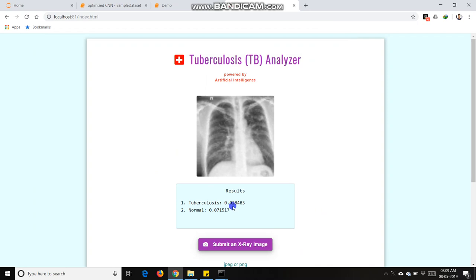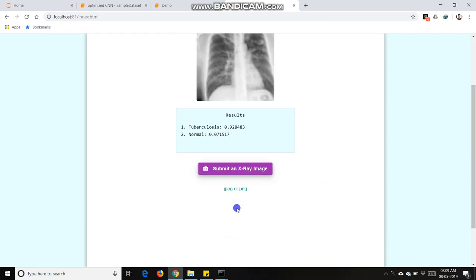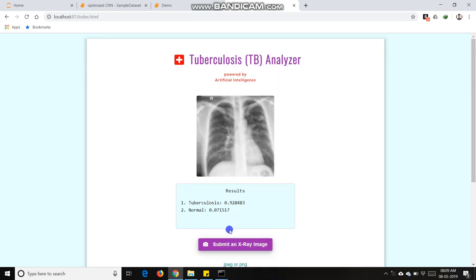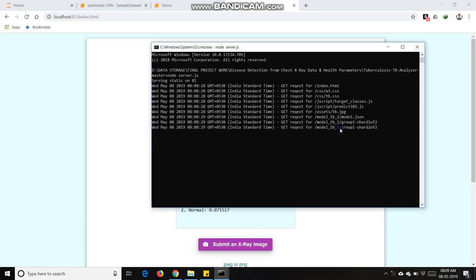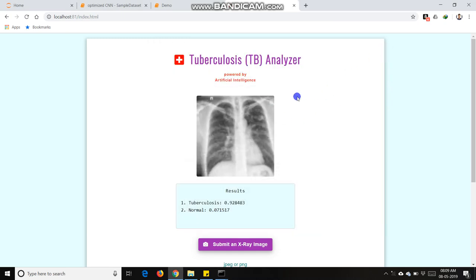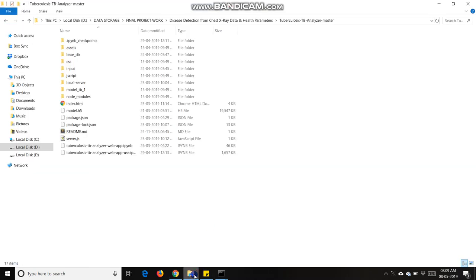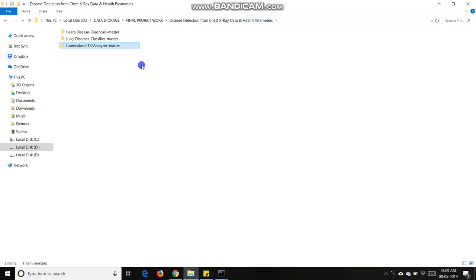It detects 92% TB and 7% normal. We can see the backend, all these files get loaded. This is my model file. The major benefit of Node.js technology is that it's very quick in response and reaction because the model gets loaded in browser and it makes prediction directly from browser. Now I am going to discuss my second project.